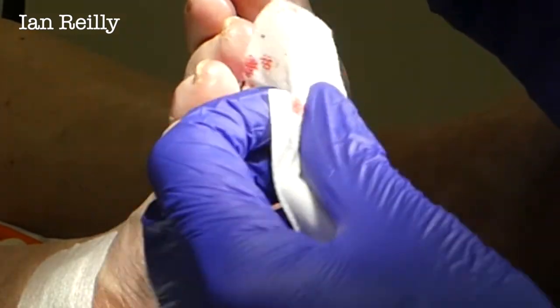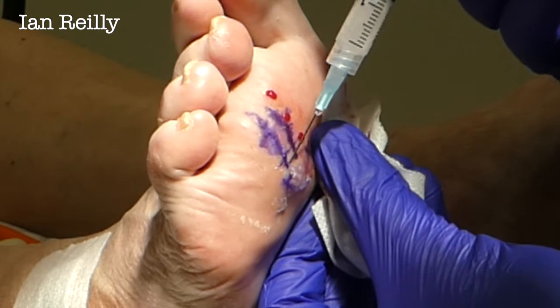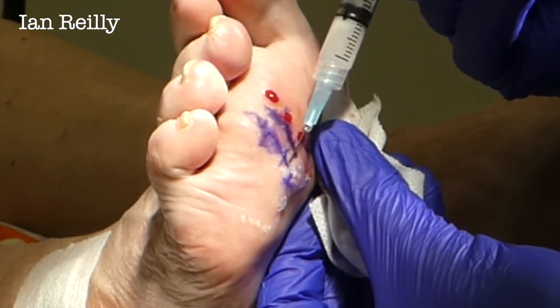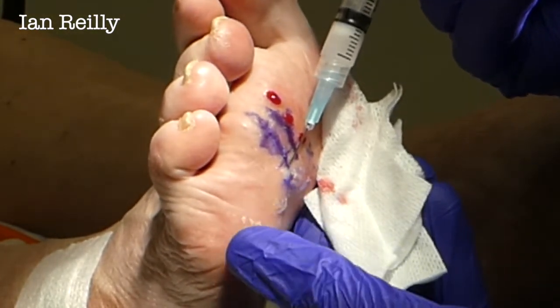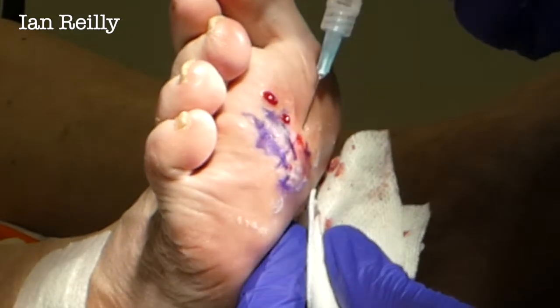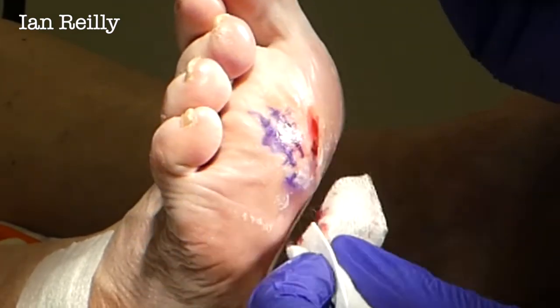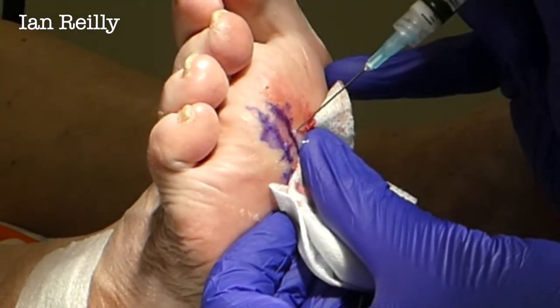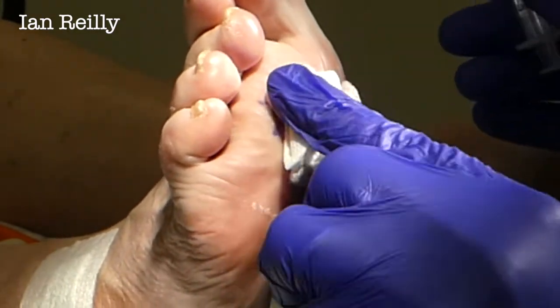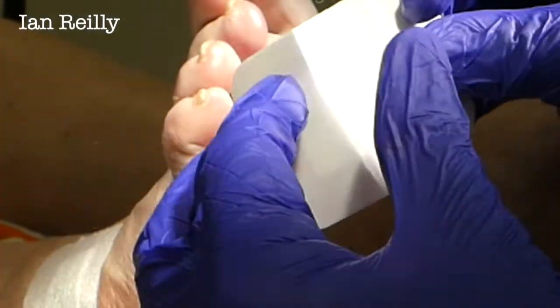I'm going to come back and put a little bit just underneath the metatarsal head because she's a little bit sore there. Can you see that blanching on the camera? A little bit under three, correction — four. A little bit under three. Really not a lot of tissue there at all. I'm just going to put the last little bit just back under there where she's most sore, and that's it. We don't resheathe — we'll get rid of that. Sterile dressing over the top.